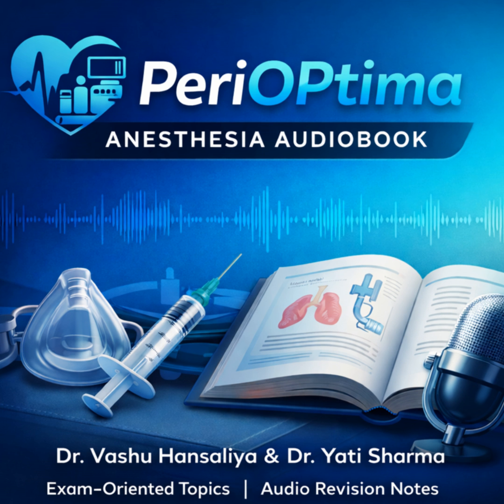Section 6, preoperative assessment. The patient has an IABP in situ and is coming for surgery, maybe a non-cardiac surgery, or a return to the OT. What do I check? First, you verify the indication. Why is it in? Is it for ischemia? If so, keeping the heart rate low is crucial to maximize diastolic time. And if it's for pump failure? Then maintaining contractility is key, so you know what your physiological goal is.